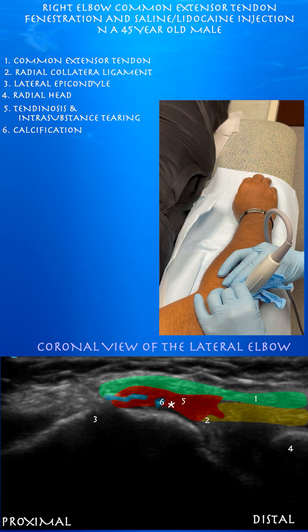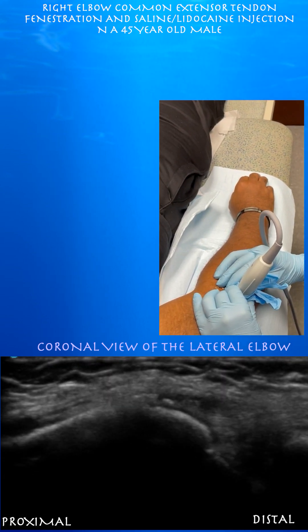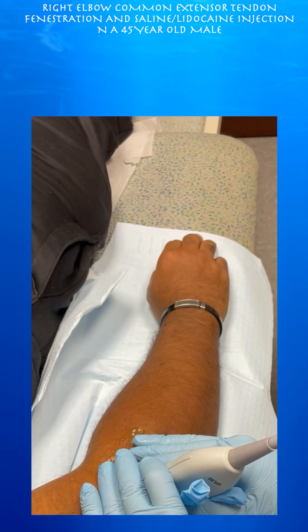As you go ulnar, you can see this dark signal consisting of tendinosis and probably intrasubstance tearing as well as calcification — probably where his pain is, with findings consistent with that. Now we're going to do some axial views.